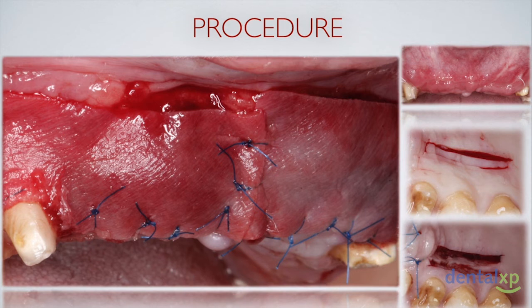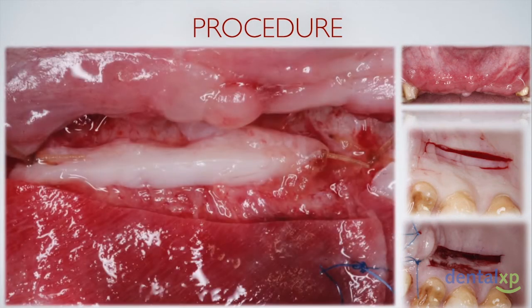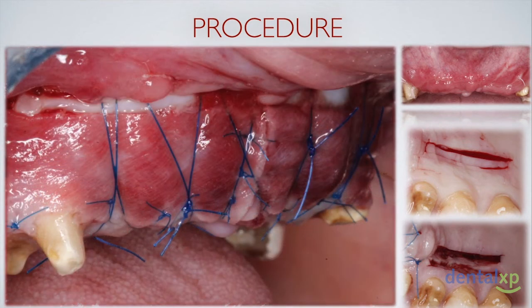Again, those are 2 mm in width, with a 2 mm distance between the borders of both grafts to allow for adequate epithelialization and thus a healing time for these areas. And the function of this graft is really to help the phenotypic induction of the mucograft by stimulating its keratinization from the apical aspect. You can see here we will use 2 resorbable sutures to fixate the free gingival graft apical to the mucograft, and the final suturing with crisscross periosteal sutures to decrease any mobility of the area and decrease the amount of dead space between the grafts and the recipient bed during the healing phase.